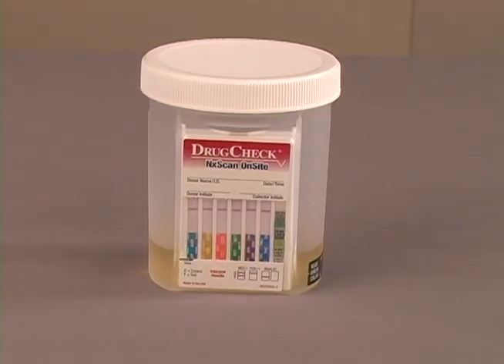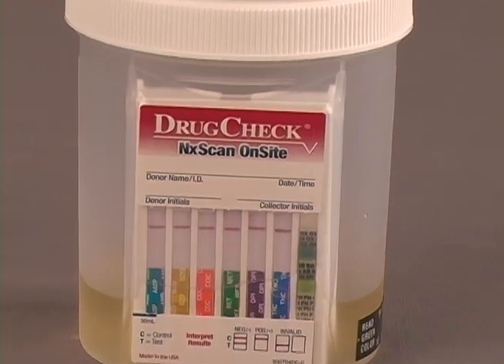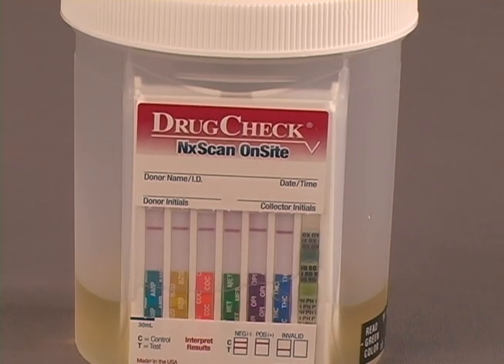Read drug test strip results at five minutes. This device was run with an all positive control.